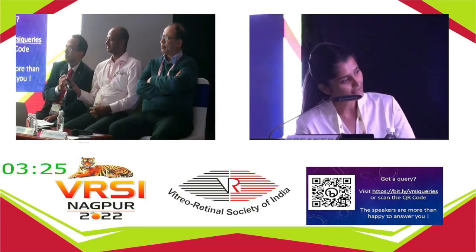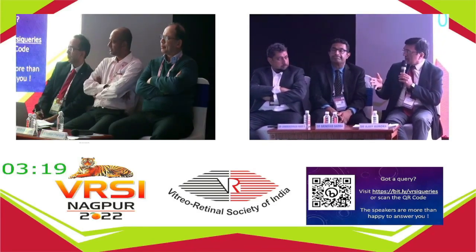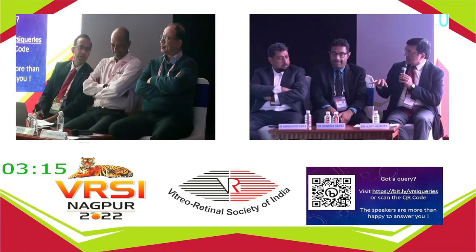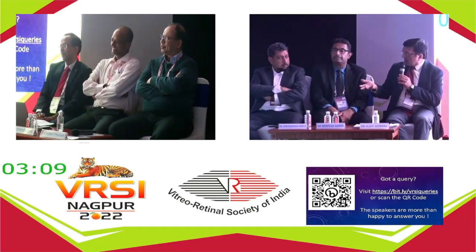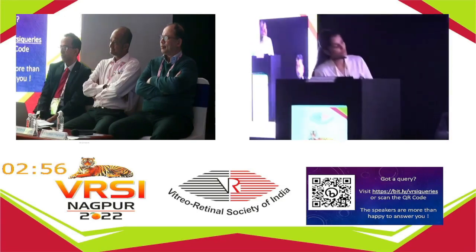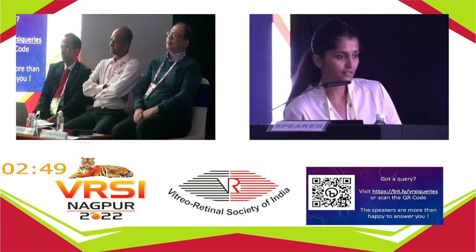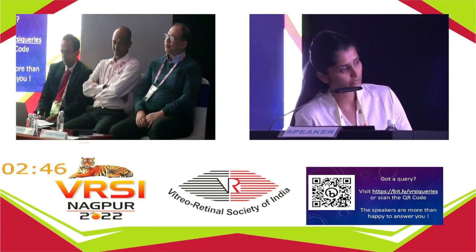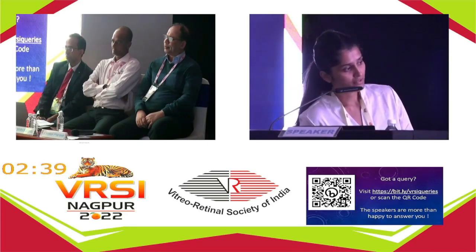Sushma, I have a question for you. Most of the screening for ROP is NICU and ICU based. And all these examinations you did in the OPD. If I'm going to a NICU, the best option available is indirect ophthalmoscopy photography or a Forus or a RetCam. The baby has to be healthy enough to be brought to the institute to do that. Do you think that's important? Yes, those babies who came to our OPDs were stable and discharged from the ICUs. That is the main problem with this ultra-wide field, that it's not portable. So we can't take them to the ICUs or the pediatric unit. That is what is required.